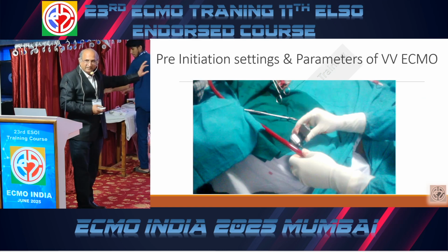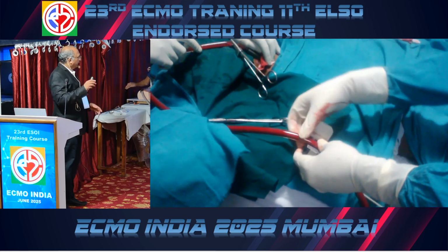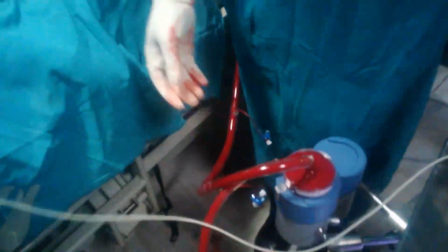Now, whatever I said, there are small video clips which I am showing you. Okay. See, this is what we have connected. This is the blood prime circuit. I am connecting the flow sensors on the return line. You can see the line is clamped. You can see the RPM is 700. Your flow is 0 because the return line is clamped.